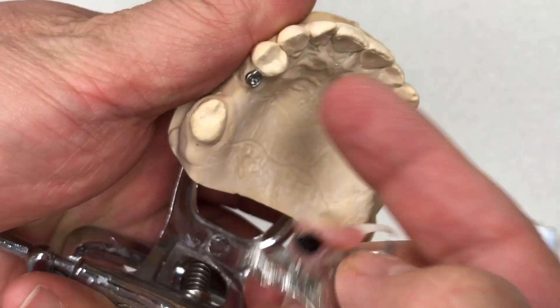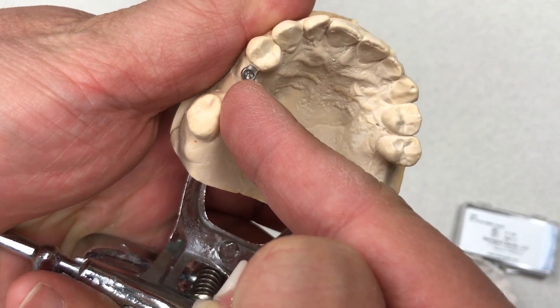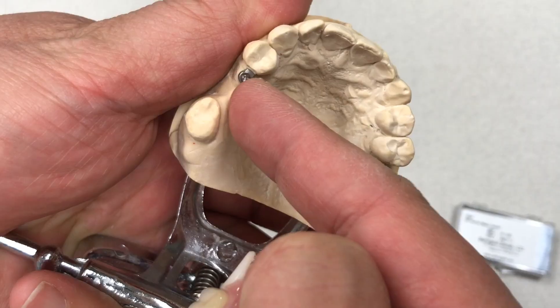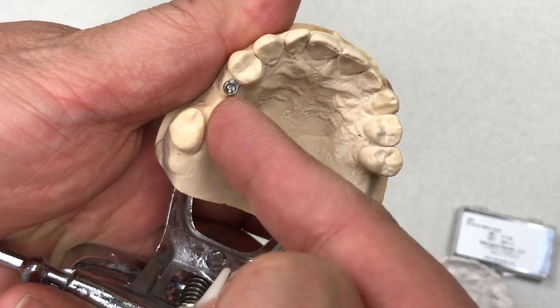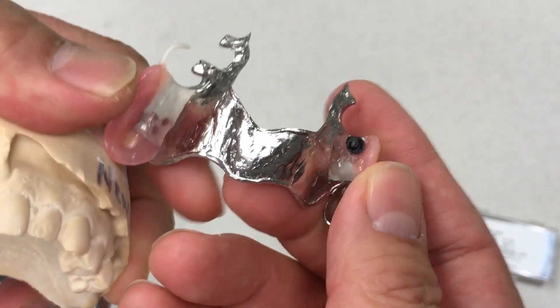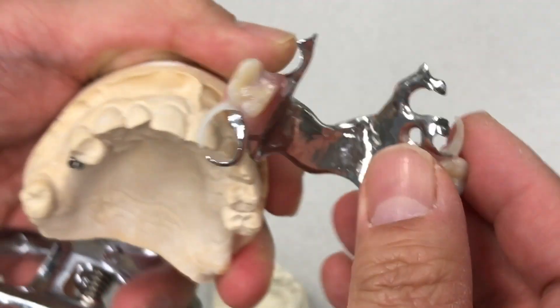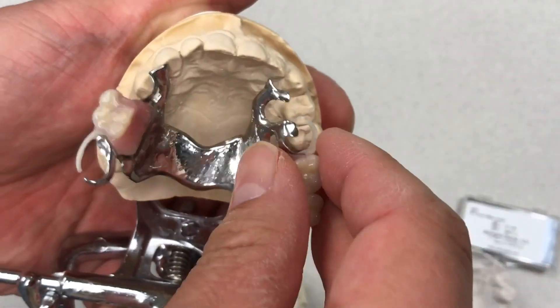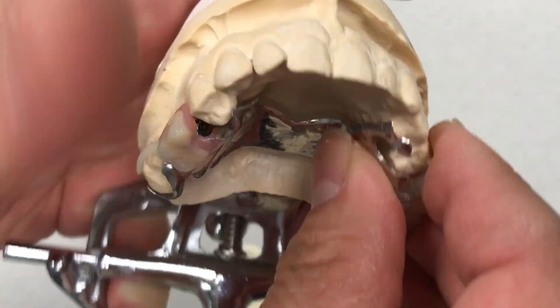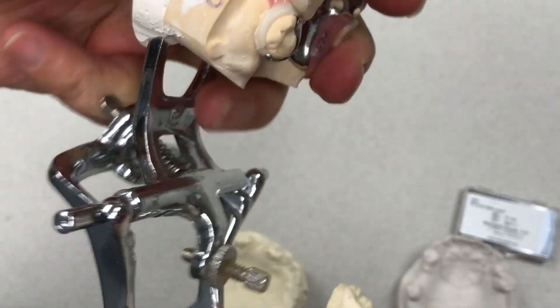Here's another cool case — we finished an ERA attachment. They made a crown, then put the female attachment in after taking the impression correctly. We made the tooth collar — Duracetal — then made the frame design, put it in the housing, and finished it. This is beautiful. Just finished this top, and now we send it out to the doctor's office.